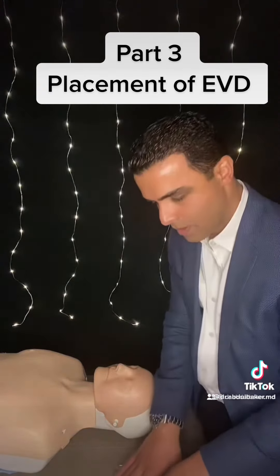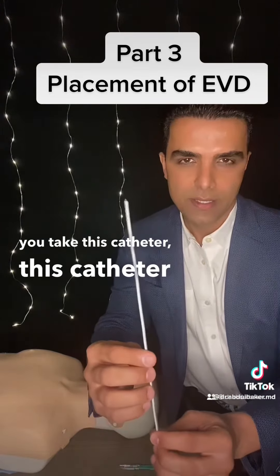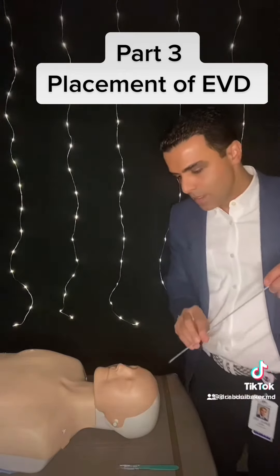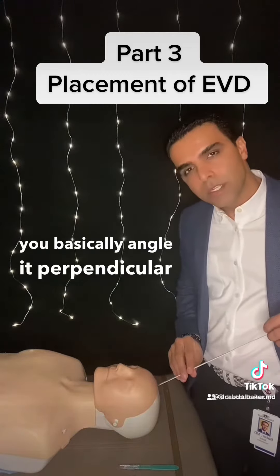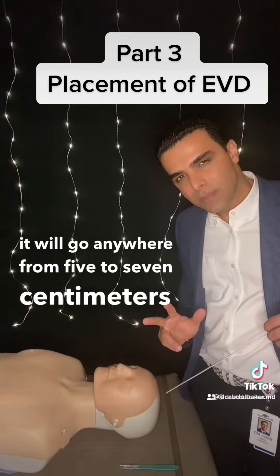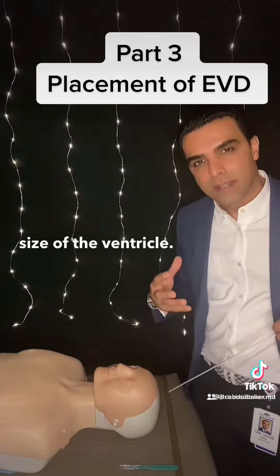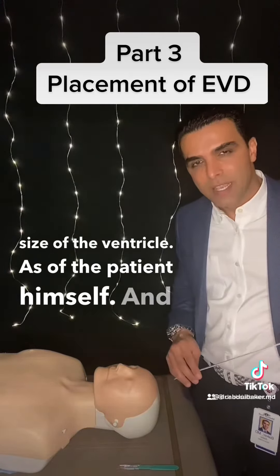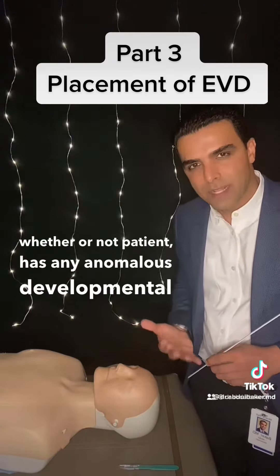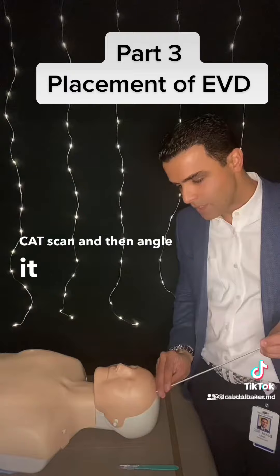You reach the inner cortex and you want to puncture the dura, and then you take this catheter. This catheter is a non-bacterial catheter — it's not an antibiotic-impregnated catheter. You basically angle it perpendicular to the skull, and you go anywhere from five to seven centimeters from the skin. There are some variabilities in the size of the ventricle, size of the patient, and whether or not the patient has any anomalous developmental problems. You have to be cognizant of that. See the CT scan, and then angle it into that space.